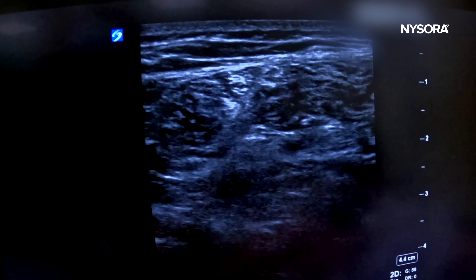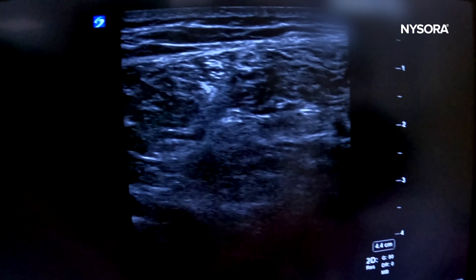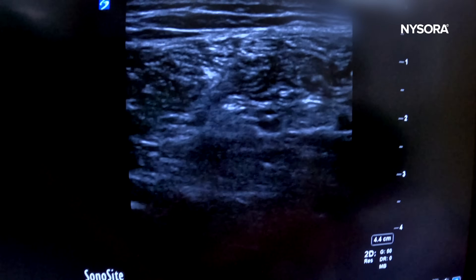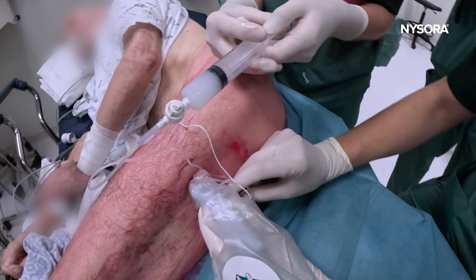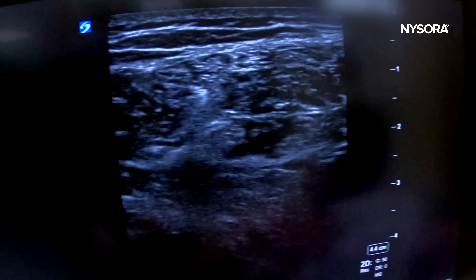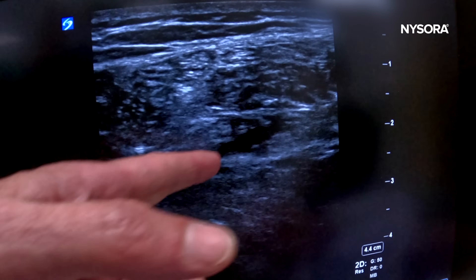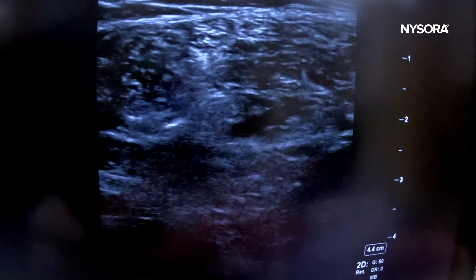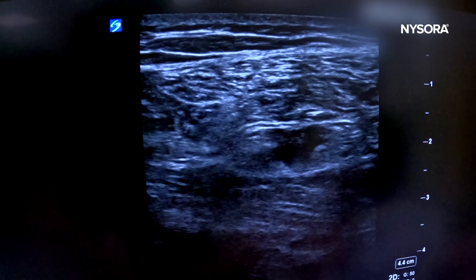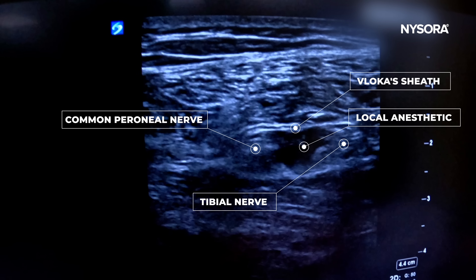Inject. The tibial and common peroneal nerve are now clearly visible with a beautiful sheath of local anesthetic spread around the sciatic nerve.